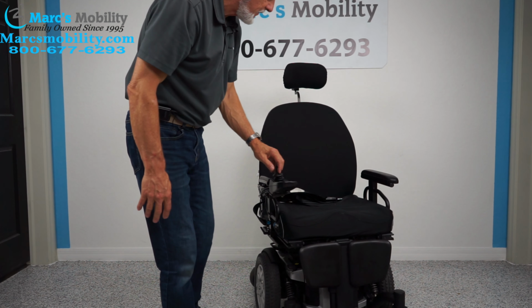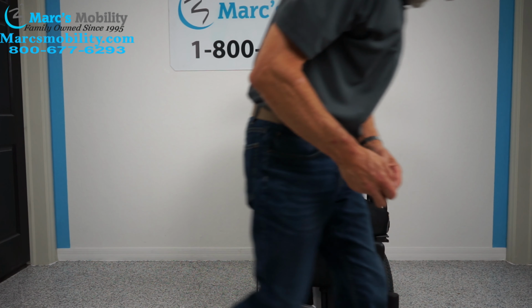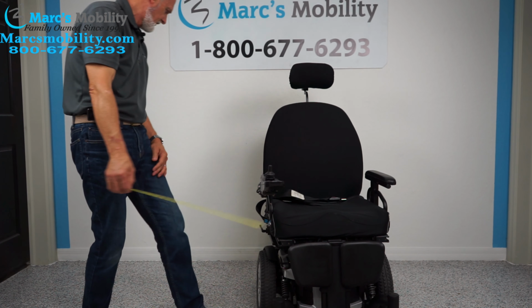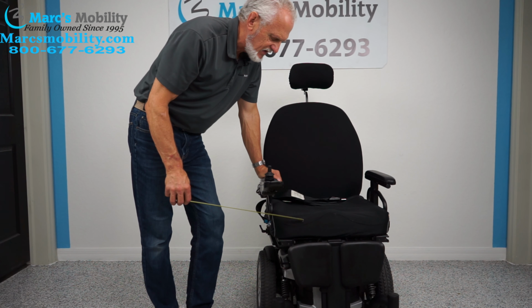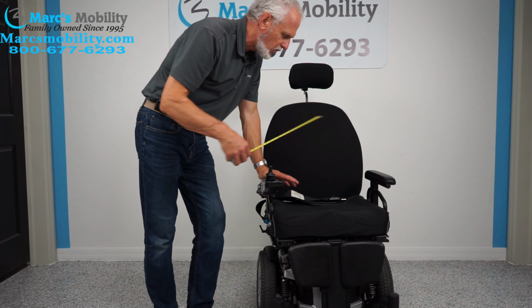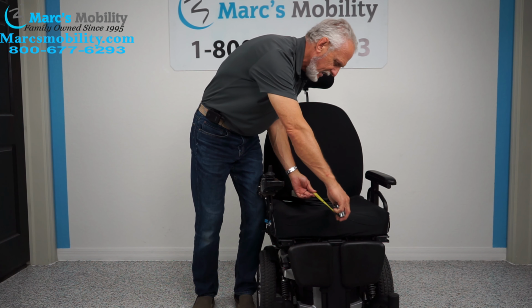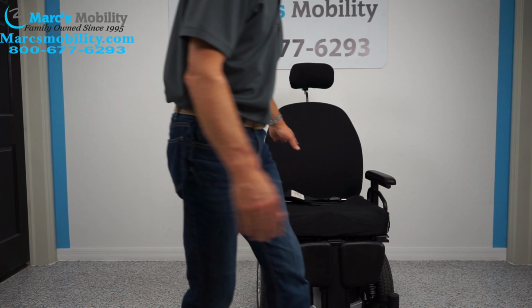The front of the chair. So we have a large seat over here. We have a seat here. Don't really know how wide the seat is, but I think it's 20 inches wide by 20 by 20. We can adjust the back forward or backward, okay? Now I cannot make the seat any bigger than this. So if this is the chair you want, this seat cannot be made any bigger. It's just an older model. So your distance between your arms is gonna be 20 inches. So 20 inches from here to here, and that's gonna be about 20 inches also, okay? This seat will not be changed on this chair, okay?